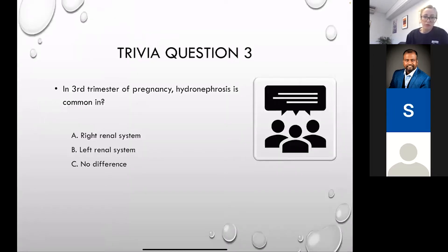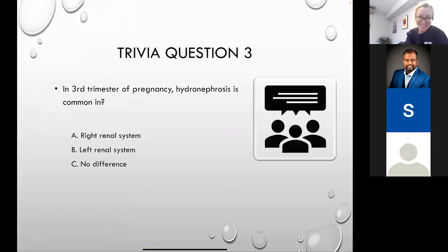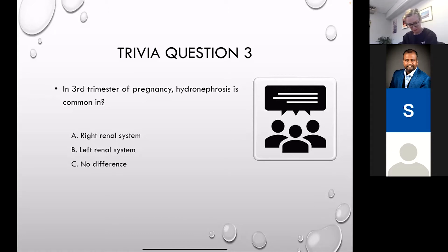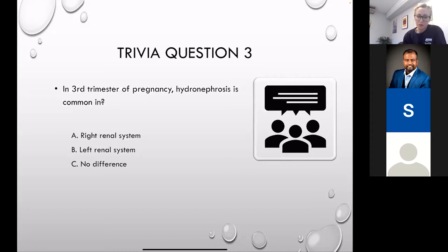In the third trimester of pregnancy, hydronephrosis is quite common — and it's most commonly on the right side, which is physiological. If you have a pregnant patient with hydronephrosis on the right side and it's just a mild one, assume it's probably physiological with the pregnancy, unless you have a solid reason to think otherwise.